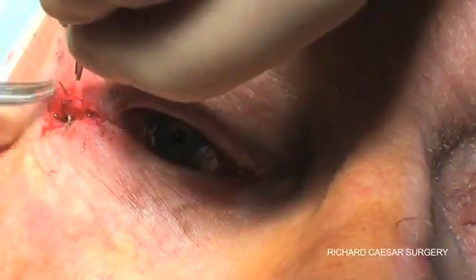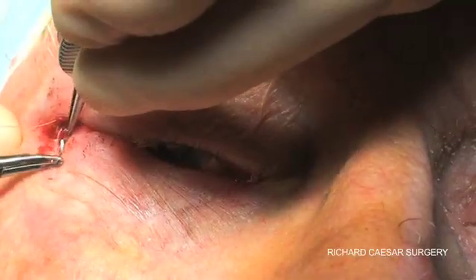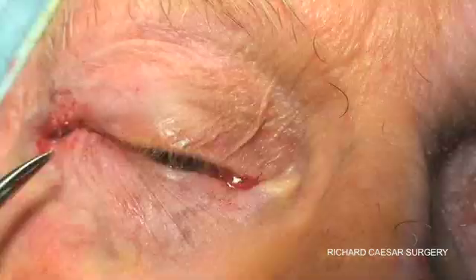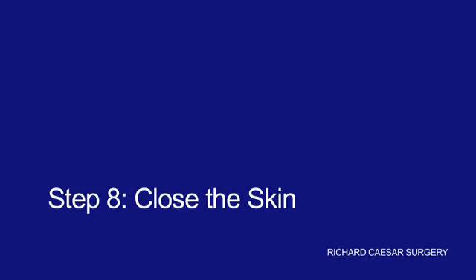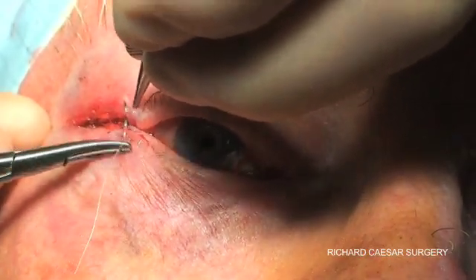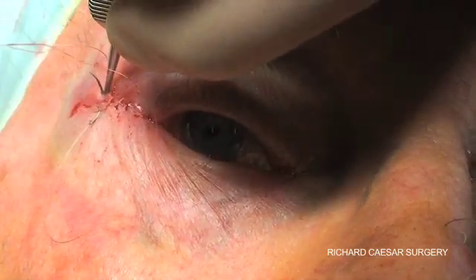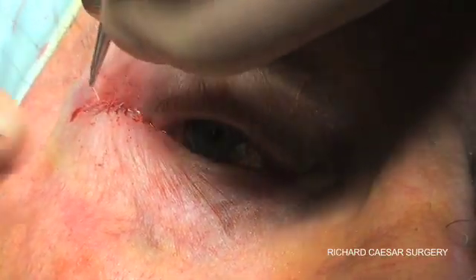If there's any gap, I put in another buried deep closure such that the skin edges should really be in apposition prior to being closed. Then all that remains is to run some 6-0 vicryl from one end to the other to close the skin. The scar from a lateral tarsal strip should really be next to invisible as it tucks very nicely into the laugh lines. I advise patients to keep these sutures moist with chloramphenicol, and then I see them and remove the sutures at a week.